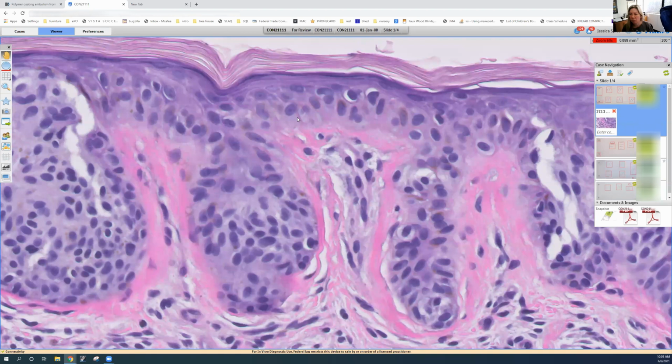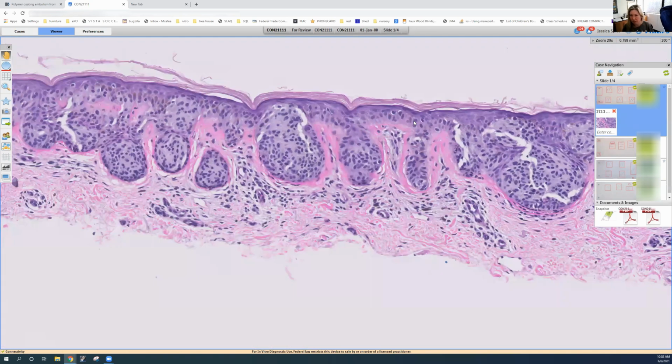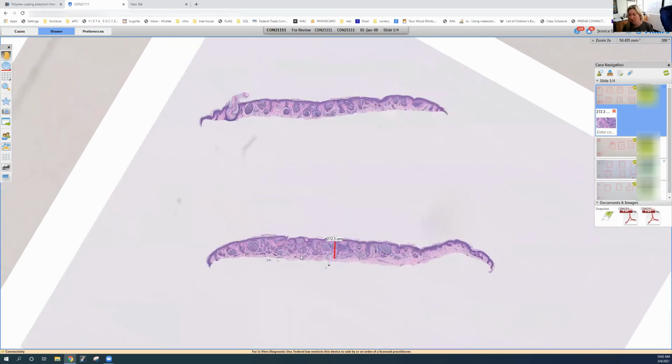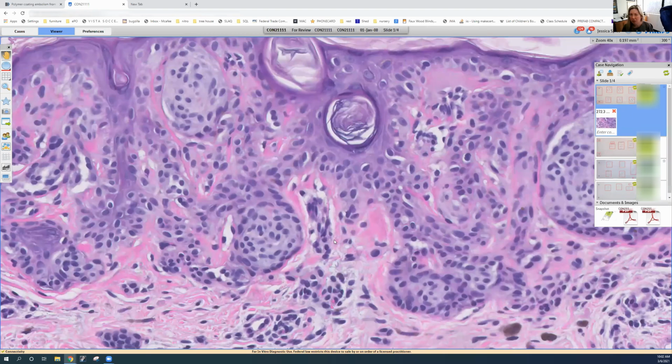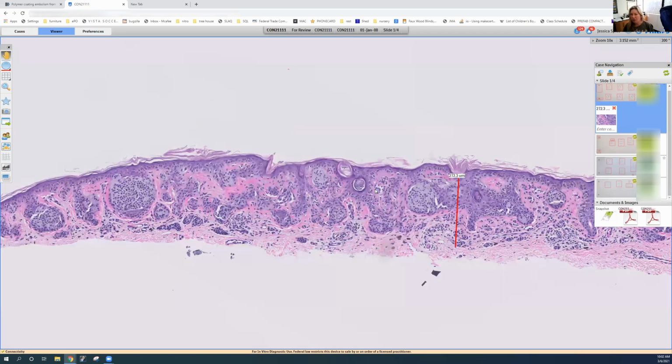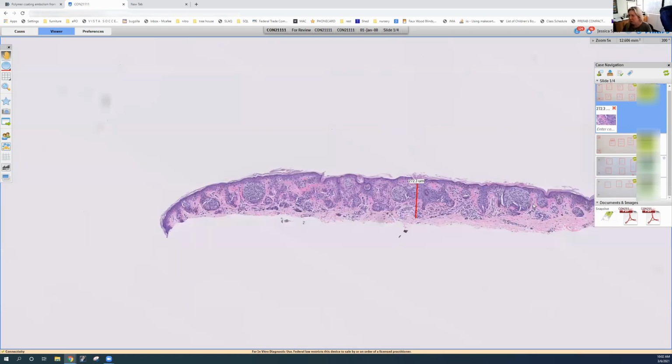These are the cells with this gray cytoplasm. Now the cells with the little melanin hats, those are the keratinocytes in between the melanocytes. And you can show this up very nicely on a SOX stain. You could also use a Melan-A stain or HMB45, your melanocytic IHC of choice. Most people use SOX10 these days. And actually, I didn't do a SOX10 because I thought I really could see the melanocytes really well in this case. I thought, could this be a nested melanoma? So I'm showing this case because I want to talk about PRAME.